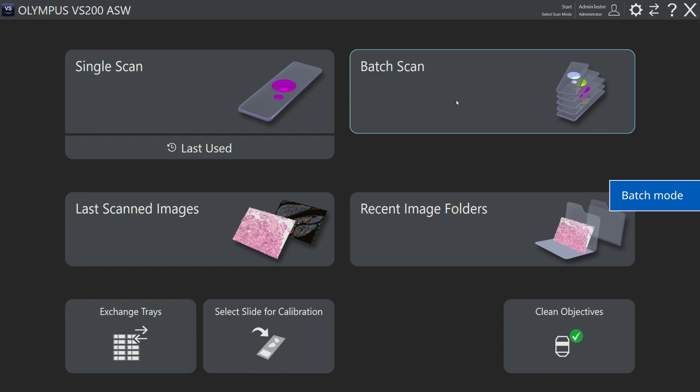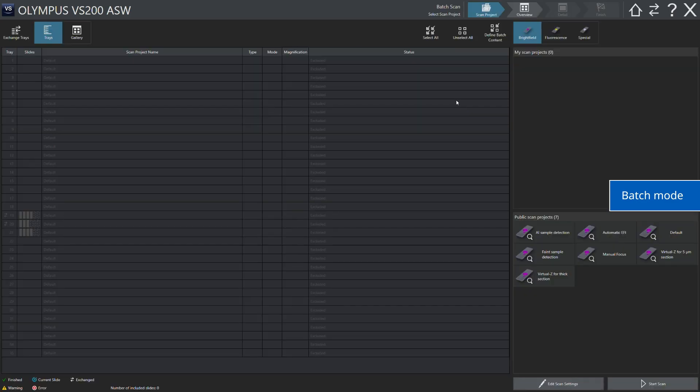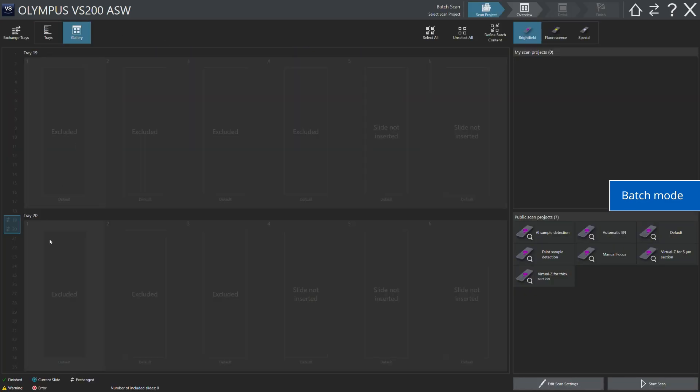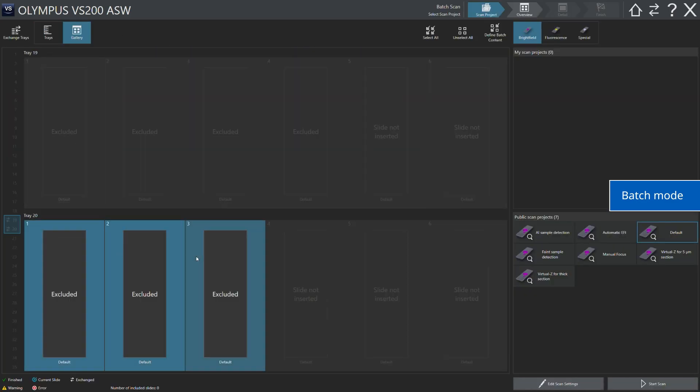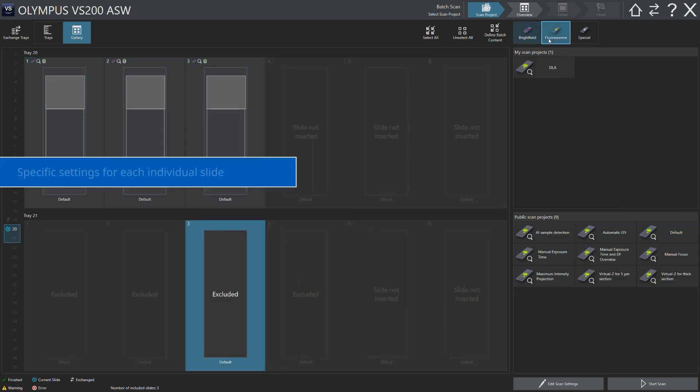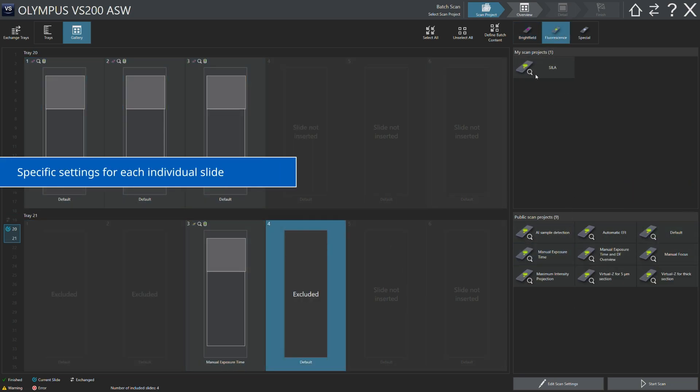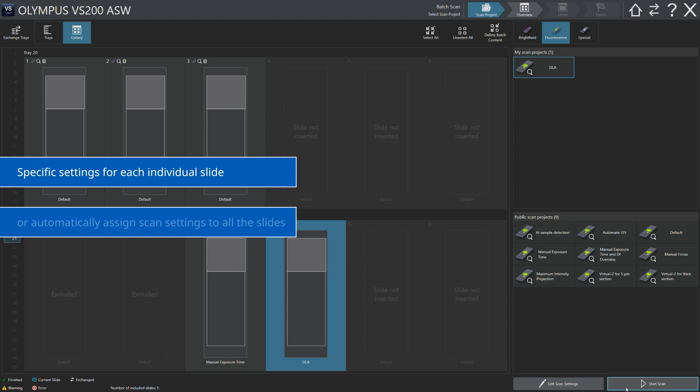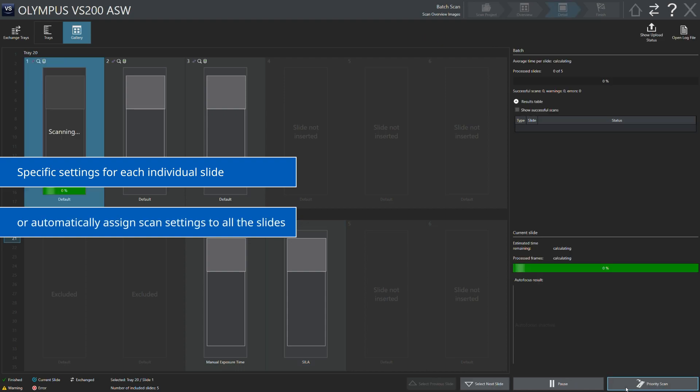The batch mode enables you to set and scan all the slides, even if you are using different types of trays. The identical settings mode enables you to automatically apply the same scan settings to all slides.